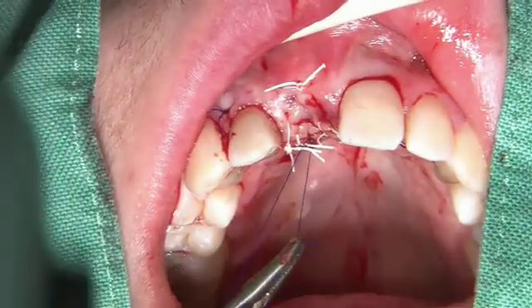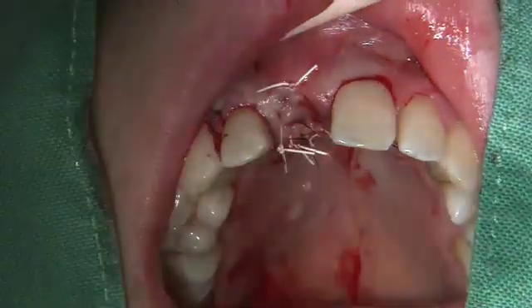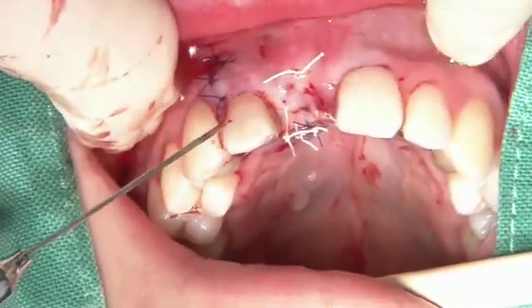And like this, we end up with a very passive suture where we have a lot of volume exactly in the area where it is most important — in the area where the future crown margin will be positioned.